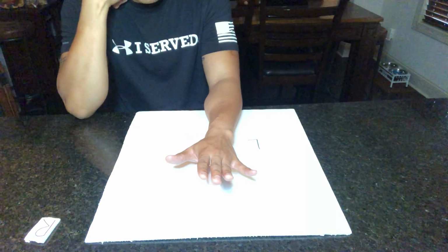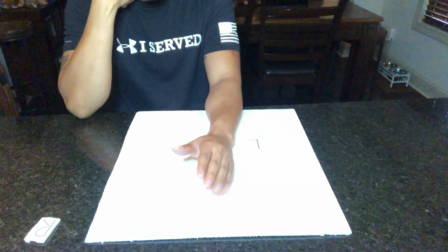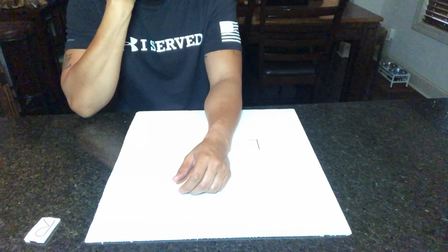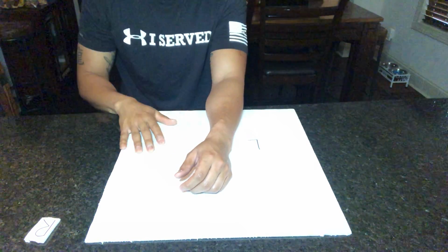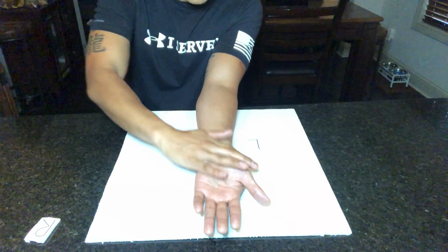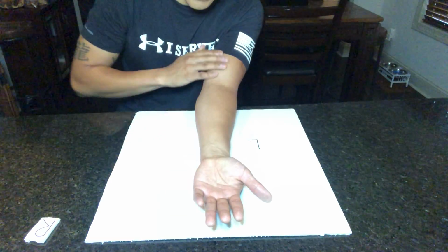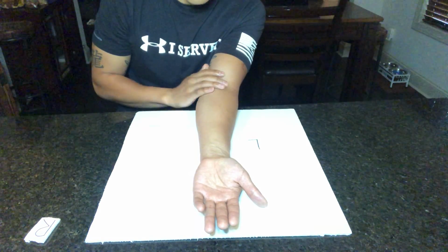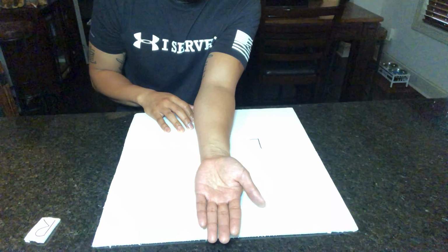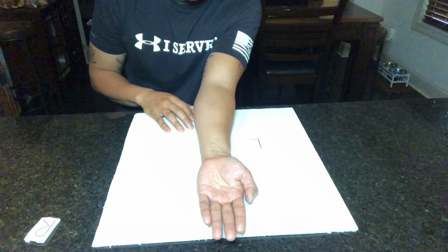All right. Next is going to be forearm. So we have two forearm views. First is going to be AP forearm. We're going to lay the arm flat on the surface here, in supine position. Again, 40 SID, 10 by 12 cassette.